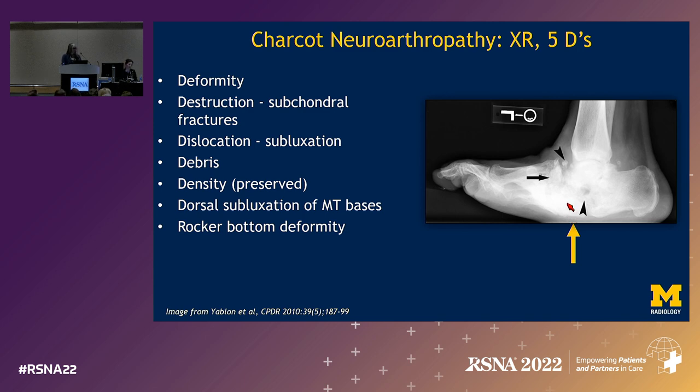We see destruction of bone, fragmentation or debris, dislocation and subluxation, usually preserved density. And in this case, we also see dorsal subluxation of the metatarsal bases due to destruction of the Lisfranc joint.